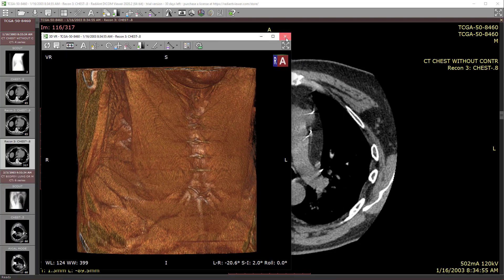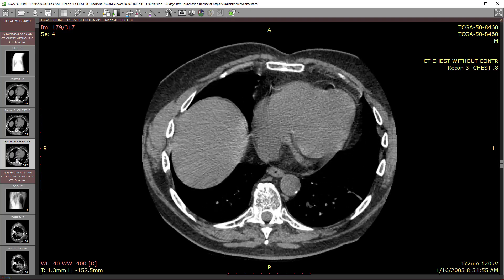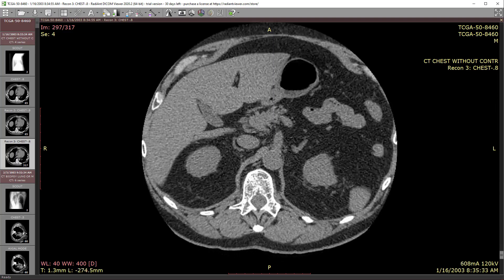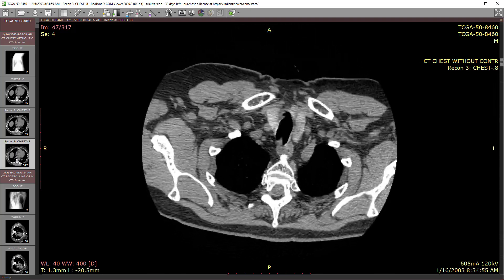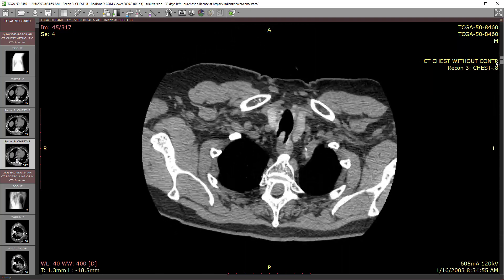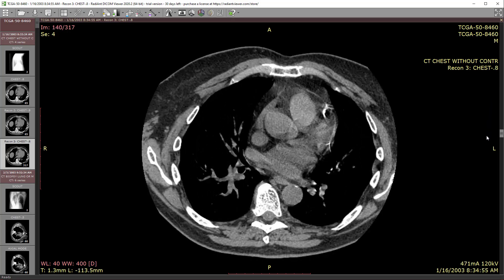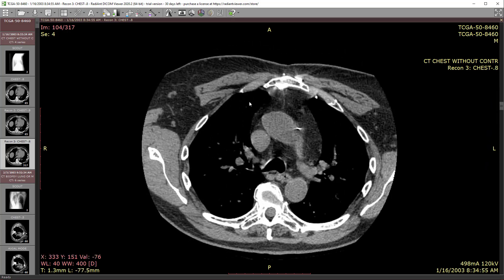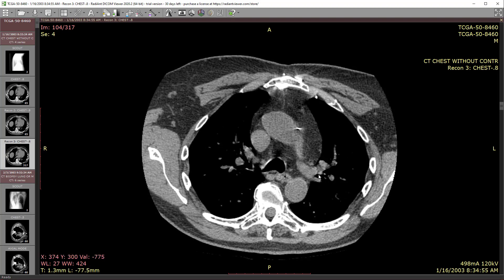One of those is a cross-section view where you can scroll through the cross-section of the body. As you go higher or lower you'll see the scapula and ribs kick in, and you can identify and look at the volumes of the muscles in cross-section. You can even middle-mouse drag to increase or decrease the contrast.